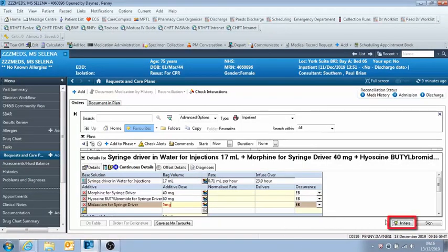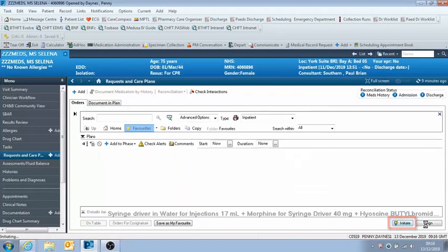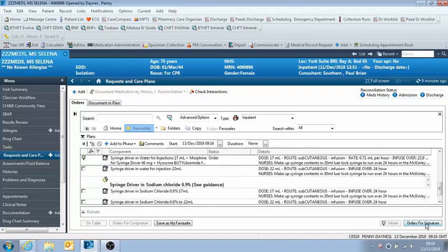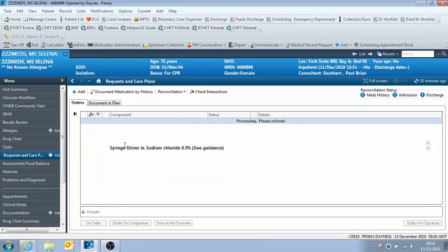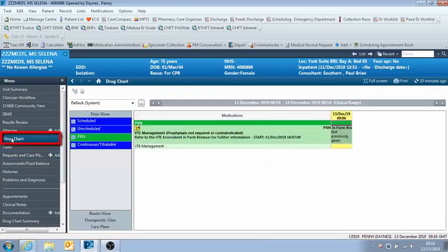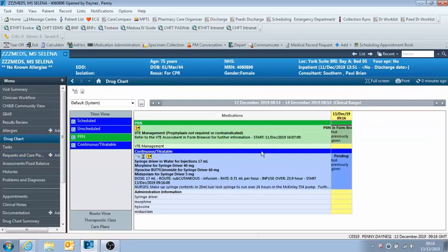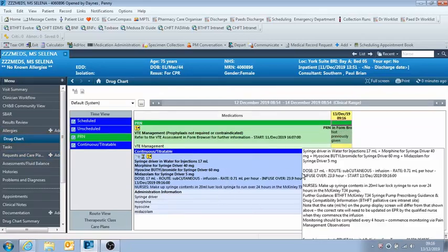And then once that's all done, you need to click initiate, and then orders for signature, and sign it. And then once you've prescribed something, it's really important you go back into the drug chart, click refresh, and then you can check that you have prescribed what you intended to. So you can see it's just come up there.